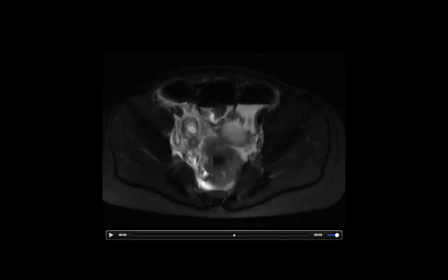You actually see also a line at the top, up here too, right here. So I don't know. Maybe this is true chemical shift here, but what's going on on this side? Because it's asymmetric, right-left. Bit of a mystery here.